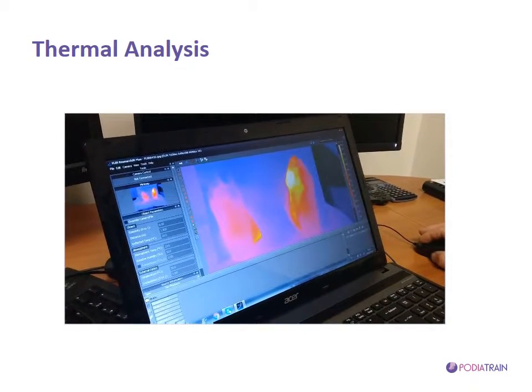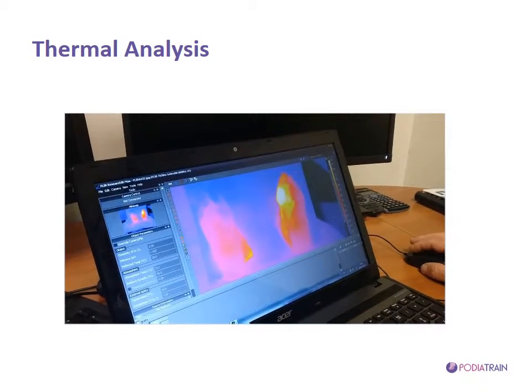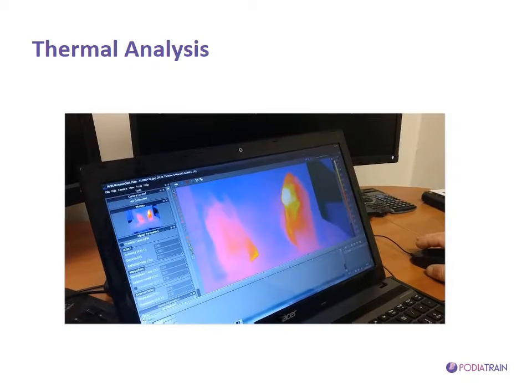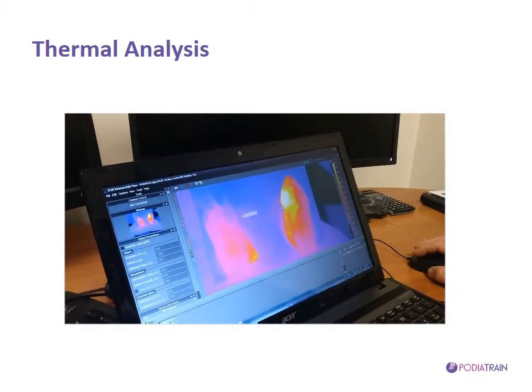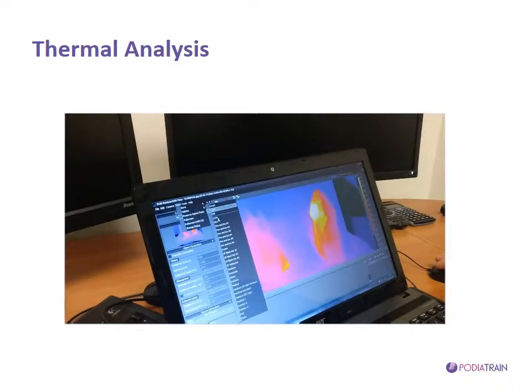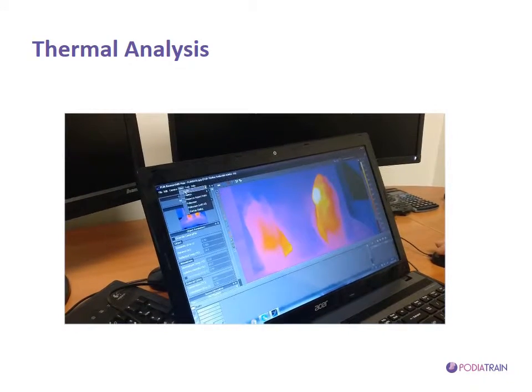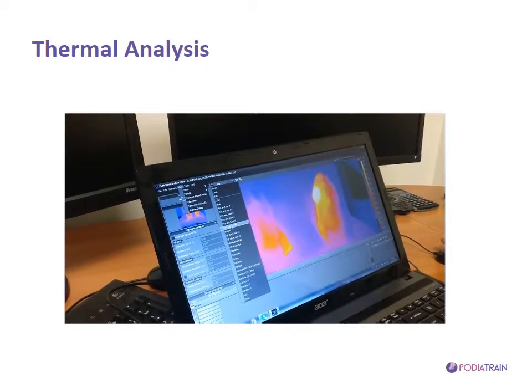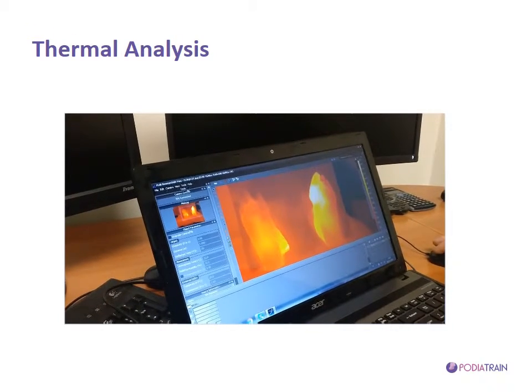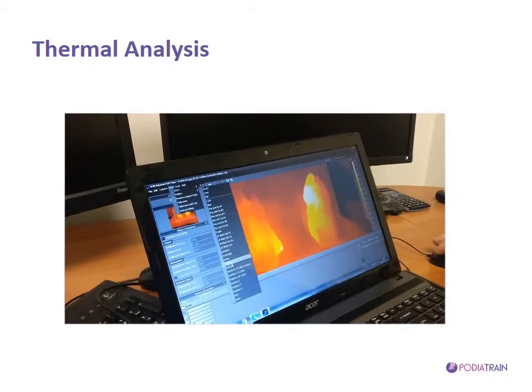These ranges can also be changed, like when we change these in foot pressure mapping technology. Also, there are various palettes that can be used to visualize this data, to make a sort of qualitative way of seeing the image, to make it easier for us to see this.